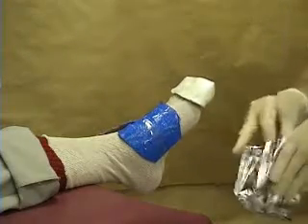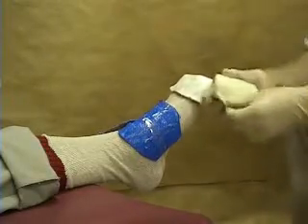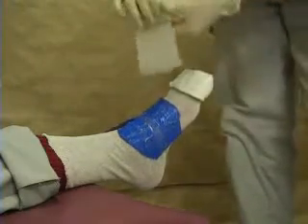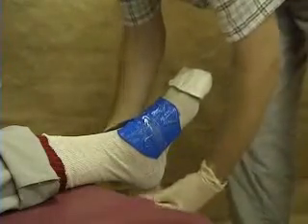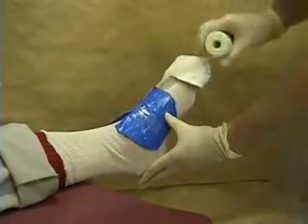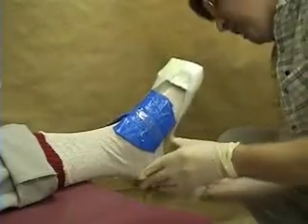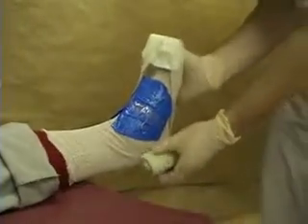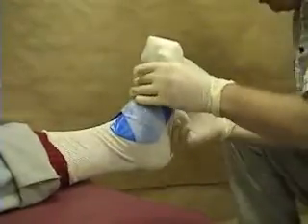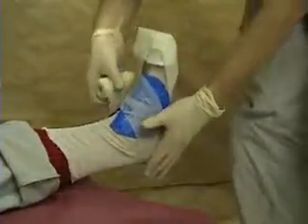Now the instructions of this material say that it can be soaked in water first, and that speeds up the setting of it. But we're not going to do that. We're going to add some water later on. That'll give us a bit more time to do our wrapping. Now while this material is being wrapped on, I'm going to ask our subject to keep his or her foot at 90 degrees. That's fairly hard to do, a fairly uncomfortable sort of position. We can take the pressure off the subject later on.